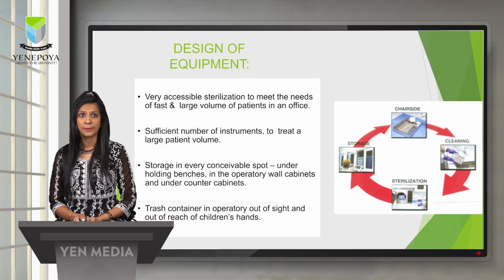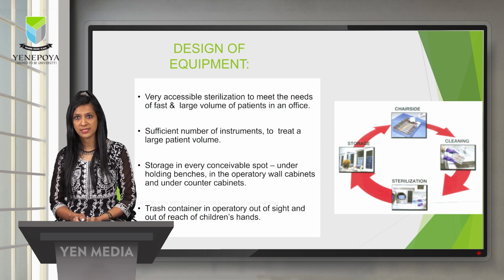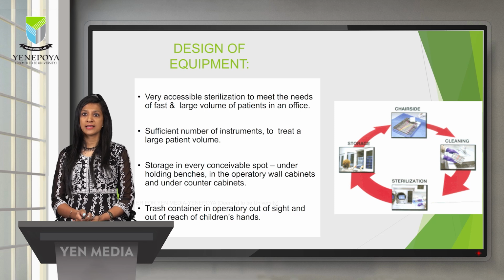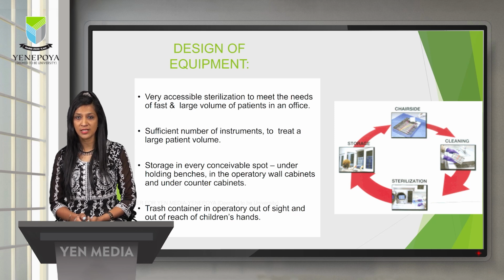The design of the equipment should include accessible sterilization to meet the needs of fast and large volume of patients in an office, sufficient number of instruments to treat a large patient volume, storage in every conceivable spot, that is under the benches, in the operatory wall cabinets and under counter cabinets, and the trash container in the operatory should be out of sight and out of reach of children's hand. So if you can look at the right hand side image, once you use the instruments chair side, you should facilitate easy cleaning, sterilization and storage, and it should be ready for use again.